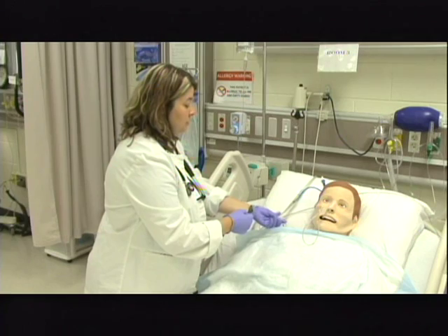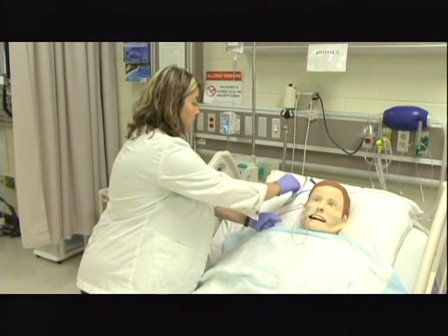So anytime I come and use the tube, I need to make sure that I'm clamping it off without pulling on his nose first of all.